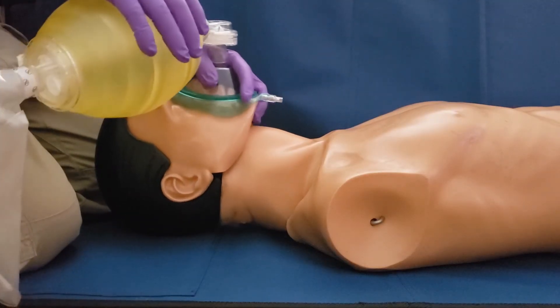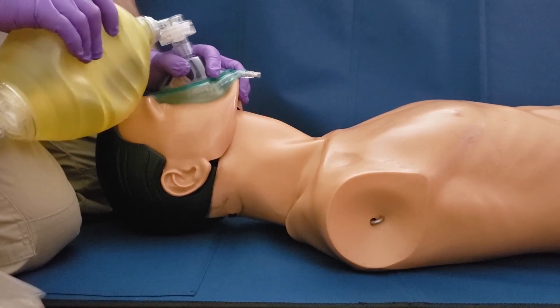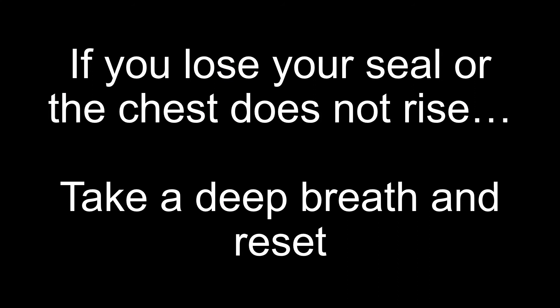Here is a side view of two effective bag mask ventilations. If you lose your seal or the chest does not rise, take a deep breath and reset. Pick up the mask, place it back on the patient's face, thumb up high, tips of your three fingers on the bony part of the jaw, head tilt chin lift, lean over the bridge of the nose and give a gentle ventilation next time around.